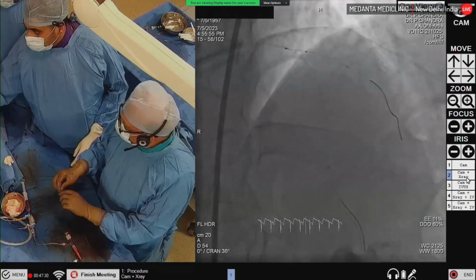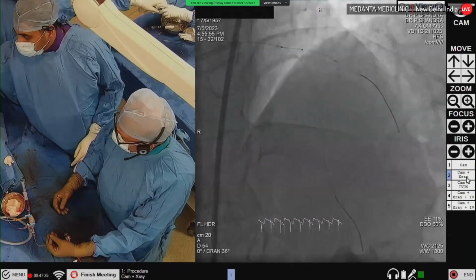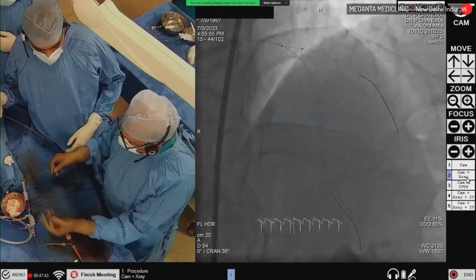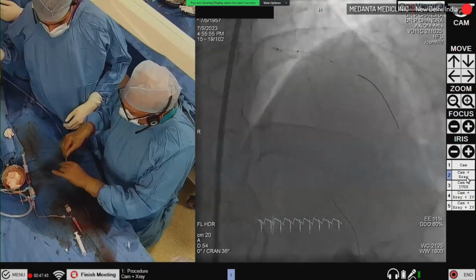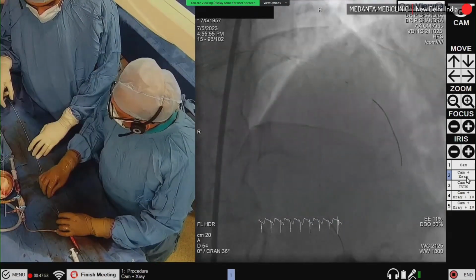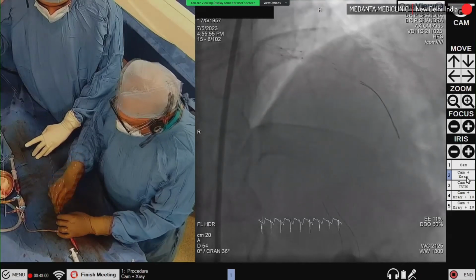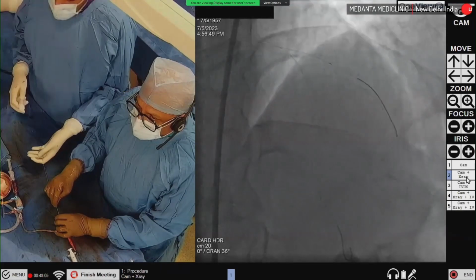Okay. So we are taking a 3.5 balloon, because this vessel was slightly bigger than 3, up to 3.25, and at approximately 3.5. We don't have to go to high pressures because we have already done high pressure inflations with a 3 into 15 cutting balloon, and the size of the cutting balloon becomes how much? Almost 3.4 at the pressure of 18 atmospheres. So 3.5 seems to be a good size for this vessel.